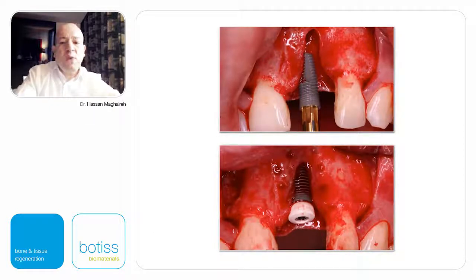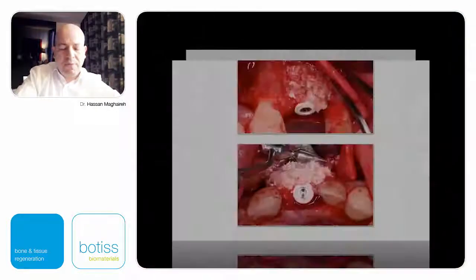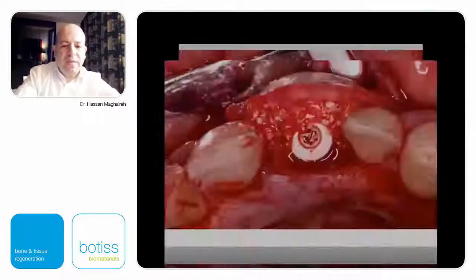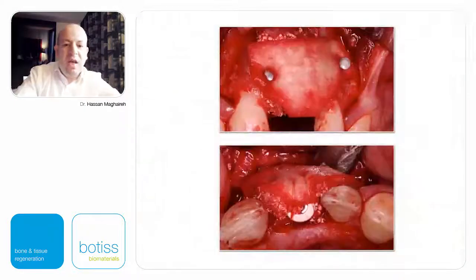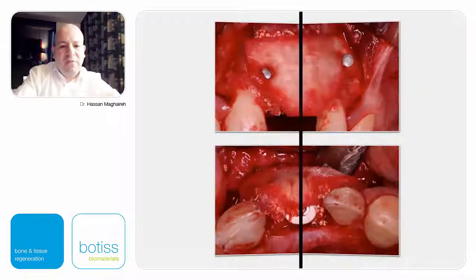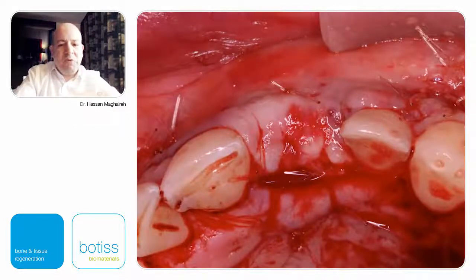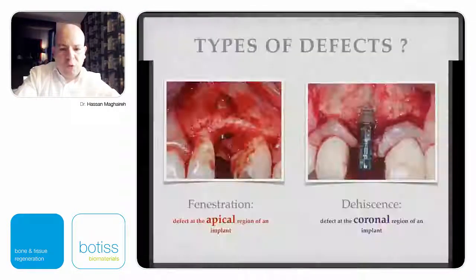This is a case where we had to use a combination. The dental implant was placed in the correct position, Maxgraft packed on the surface of my exposed threads, and then I got my Cerabone to build my convexity. And in this case, actually, I decided to use a Mucoderm as a membrane as well as soft tissue grafting. So two in one, if you like. I tacked the Mucoderm on both sides, and this is a really good advantage. And then I even sutured the Mucoderm coronally to give me really good stability. You could see how we managed to build the convexity, a straightforward one.